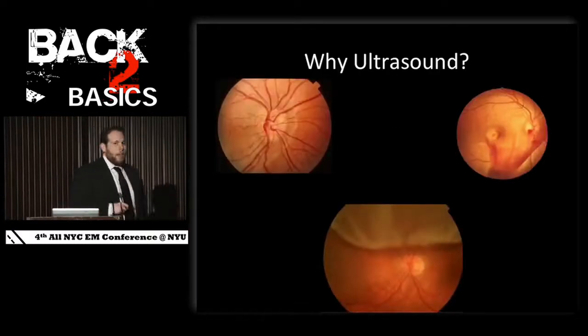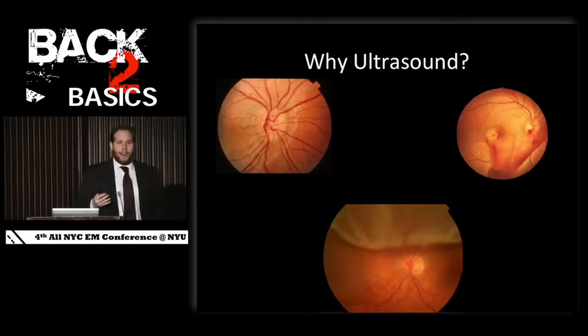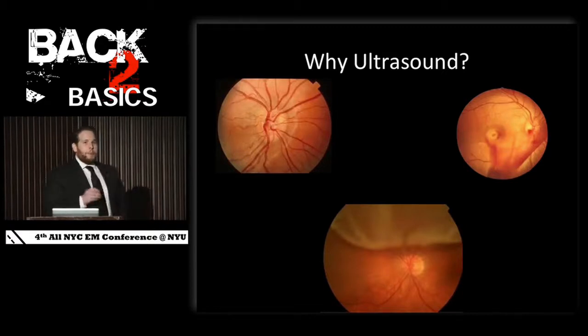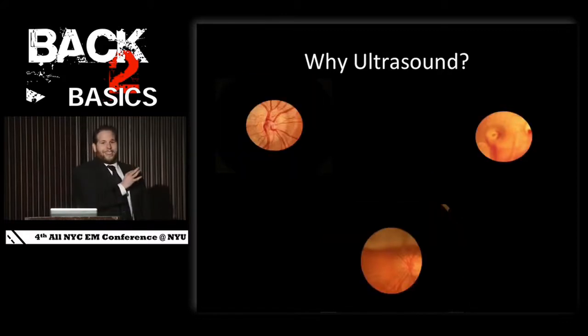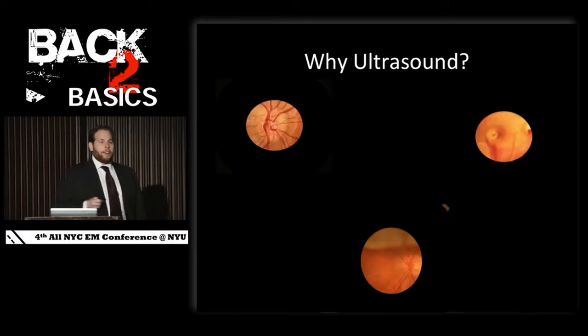So, when we think about ocular ultrasound, or eye exam in general, we think about the fundoscopic exam, and we see this stuff, you know, we're all very good at recognizing it on tests. For many years we've looked at this, but how many of you have actually ever seen something that looked anything like what you see on screen in an actual patient? I think more likely, if you were lucky, you could see something that maybe looks like this, if you can get that much. And it's very difficult in our setting to get a good fundoscopic exam.